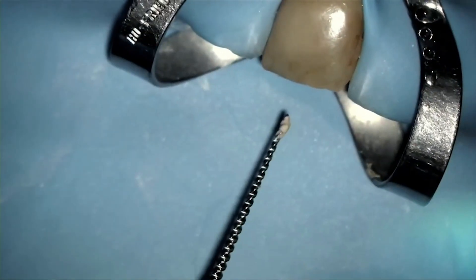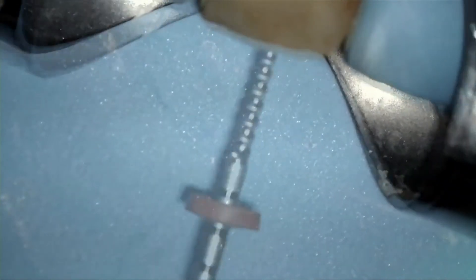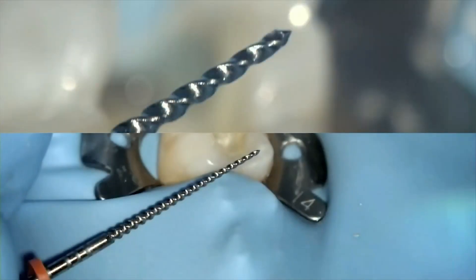Next, turn the size verifier in a clockwise direction and pull it out. Keep doing this until the tip of the size verifier is free of any debris. This is called apical clearing. This apical dentin debris often creates an apical plug which may prevent the gutta percha from obturating to length. In recap, you must use the corresponding size verifier prior to obturating with Gutta Core. This step is extremely easy and simple and will only help make the obturation go smoother.